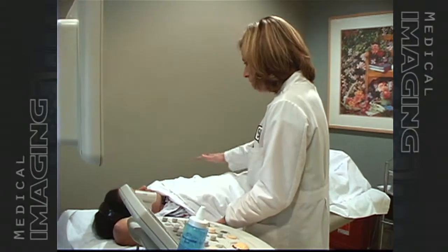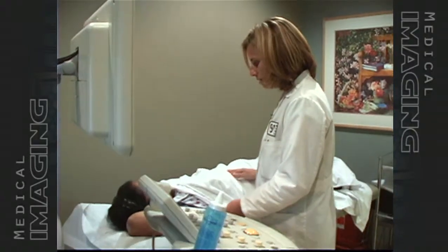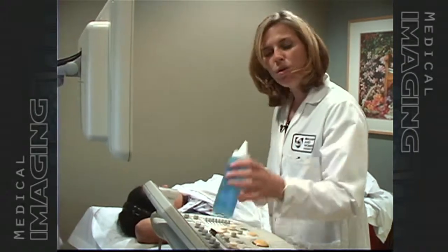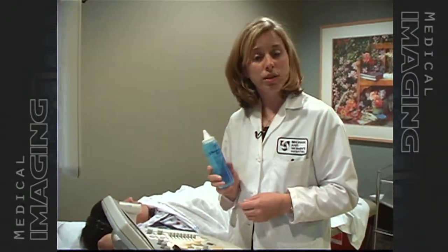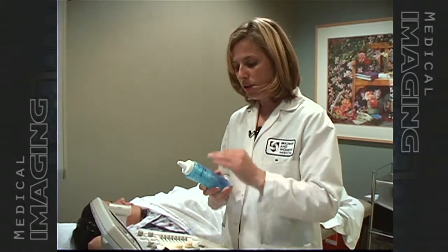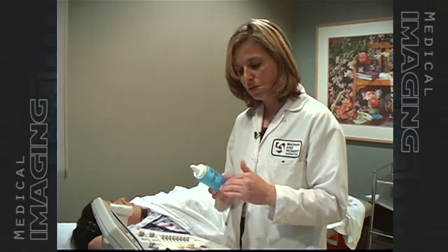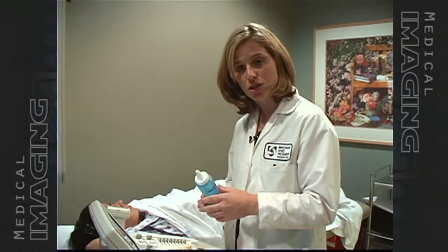So I'm going to have you just roll up onto your left side, away from me. Excellent. With ultrasound examination, we always want to use an ultrasound coupling gel, which we need to eliminate any air barrier between the ultrasound probe and the skin, so the ultrasound beam can penetrate into the tissues.